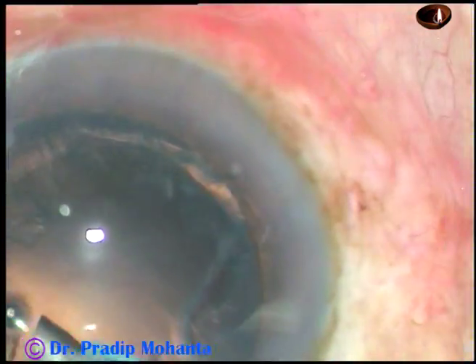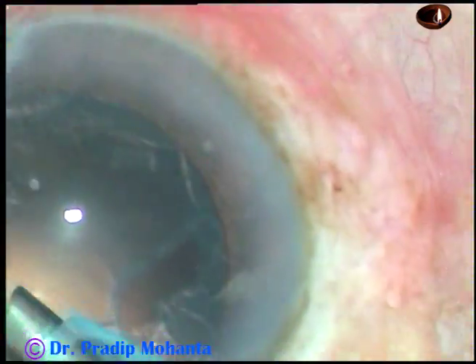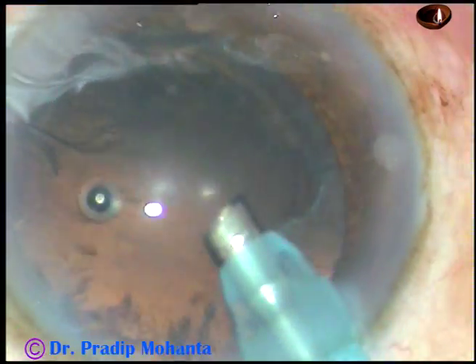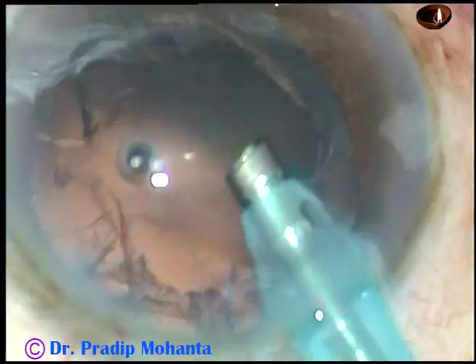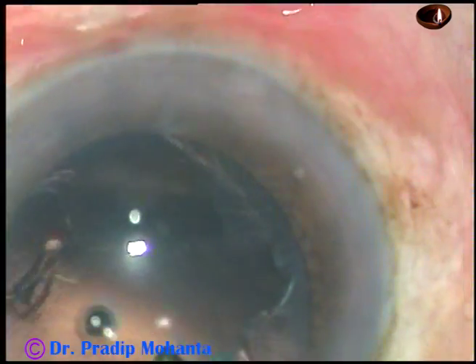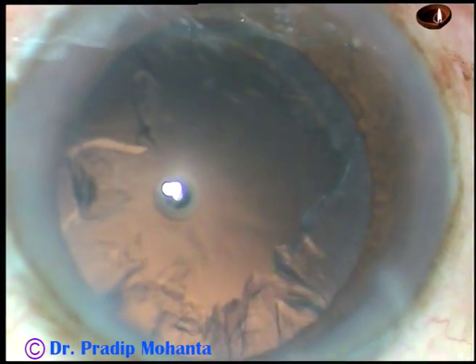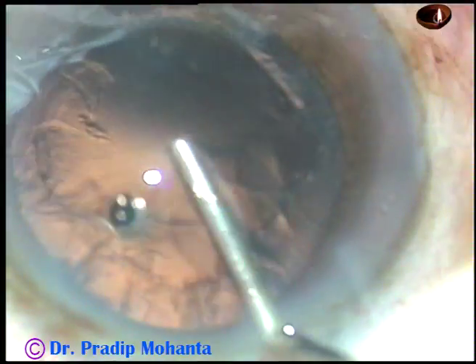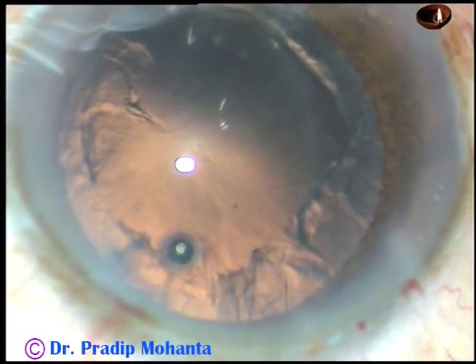This is the epinucleus — it has come out. So this has been a quick surgery. The main aim is not how fast we can be; the main aim is to be safe. We must be safe first and then quick.